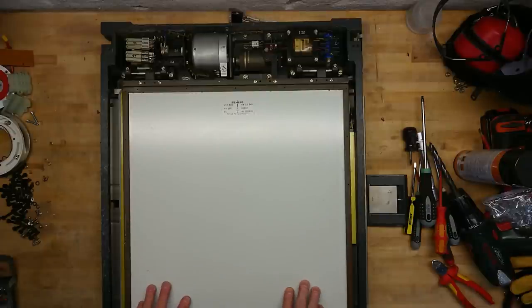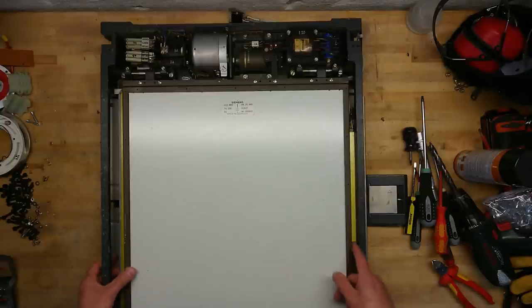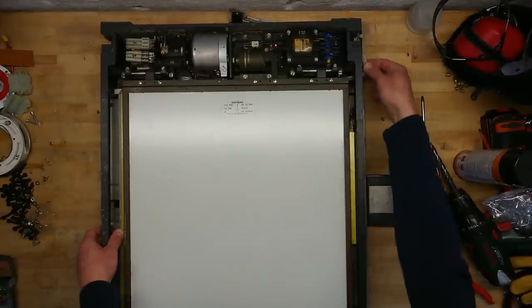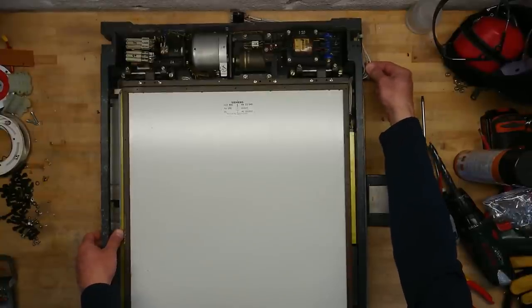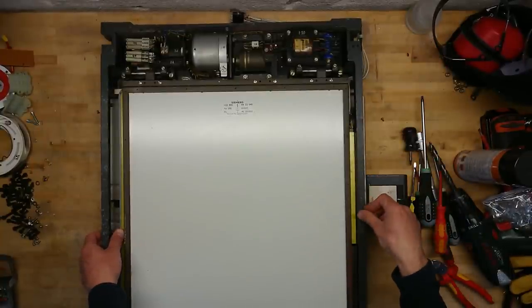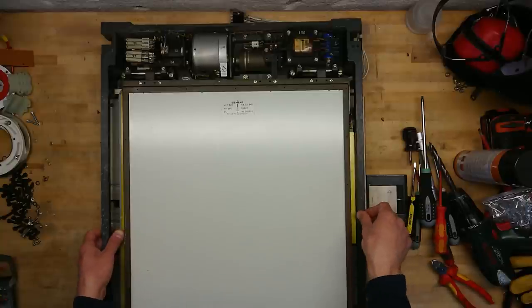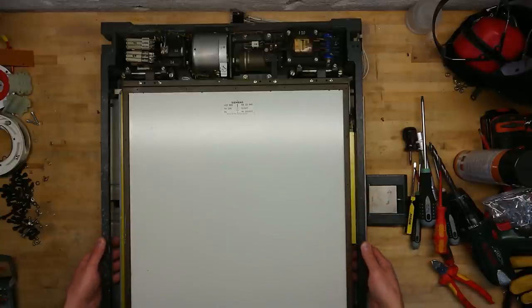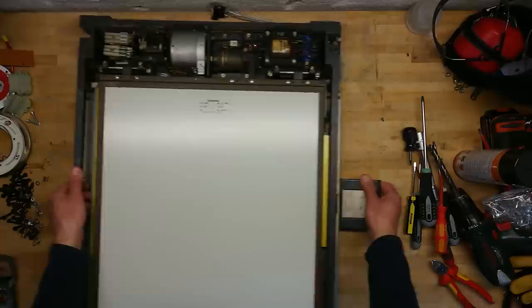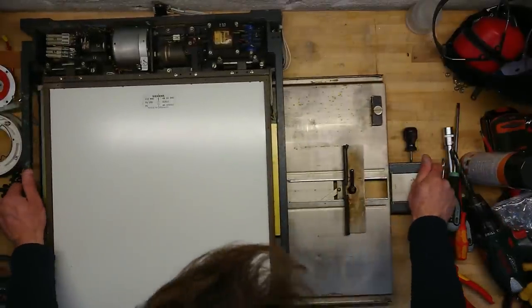That's lead. So maybe this is just a lead front plate in front of the actual sensor, because as we can see out here, this golden part actually connects down to some connectors, but there's maybe 12 wires. That's not enough for an image sensor. So there is also a cassette holder underneath here, which can be pulled out like this.